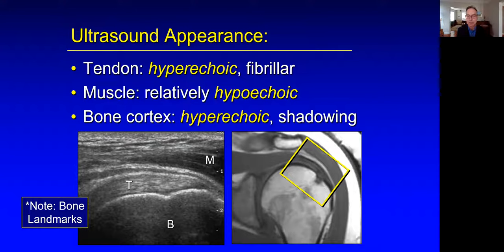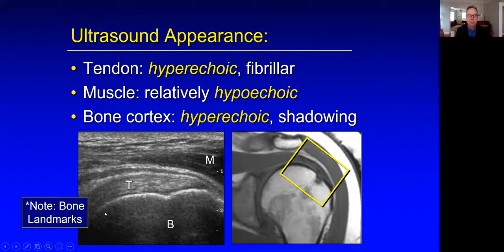The muscle is relatively hypoechoic, indicated here as the deltoid muscle in M. The bone cortex is bright, as shown on the ultrasound. Recognition of the bone landmarks is very important and helps with orientation. Noting the curved surface of the humeral head tells us where we are in space, and this looks fairly similar to a coronal oblique MRI.